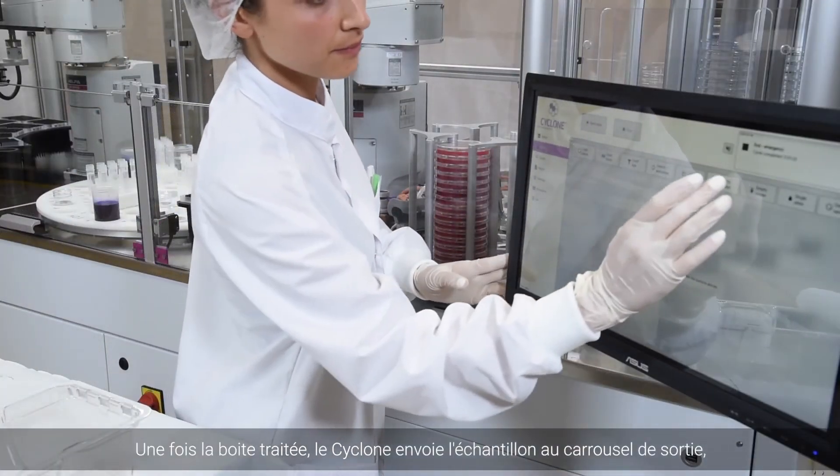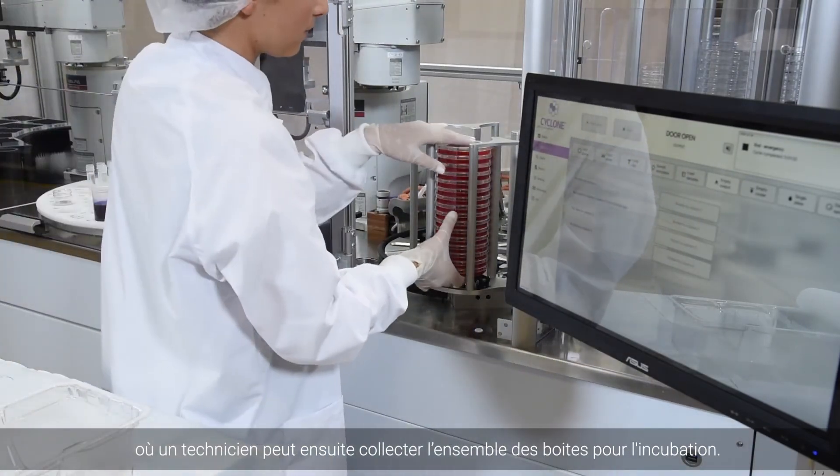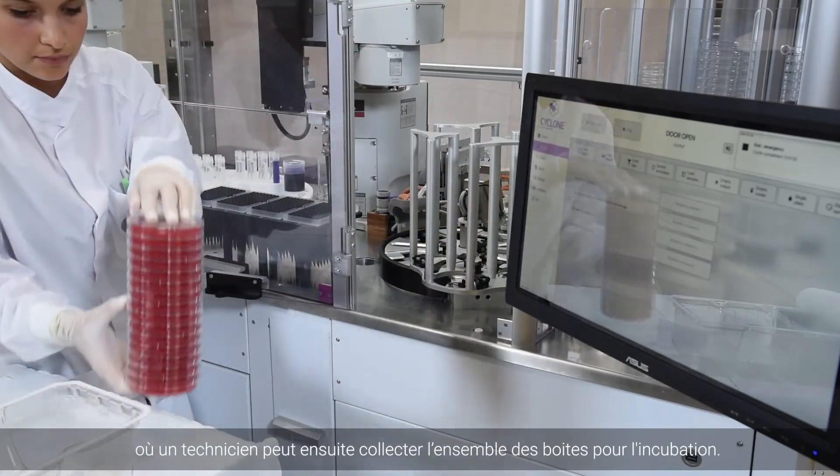Once the plate has been processed, the Cyclone sends the plated sample to the output carousel, where a technician can collect the plate for incubation.